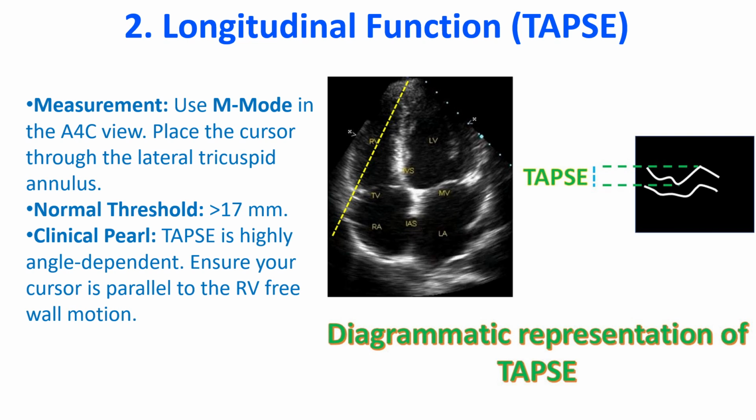TAPSE is highly angle dependent. Ensure your cursor is almost parallel to the right ventricular free wall motion.